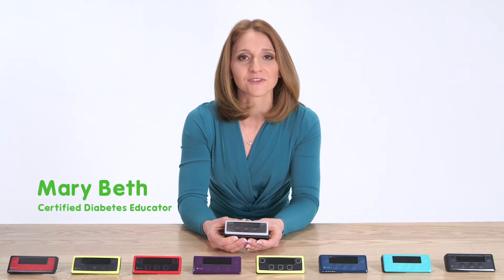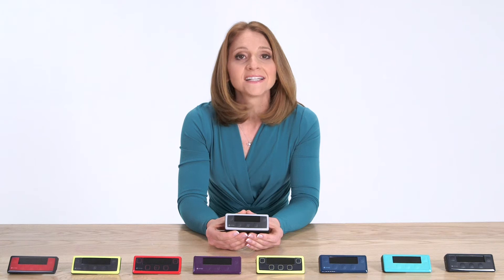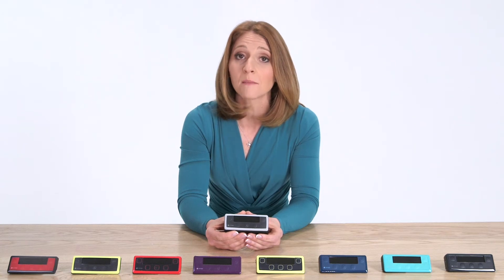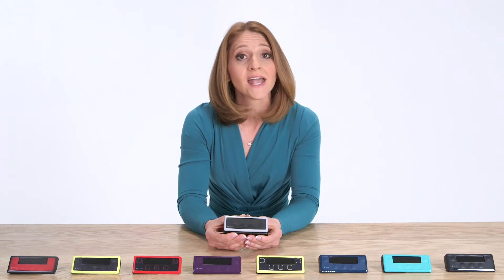Hi, I'm Mary Beth. I'm a Certified Diabetes Educator and this is a SNAP insulin pump. Today I'm going to talk with you about its revolutionary design and how its automatic features can give you less prep time and more lifetime.